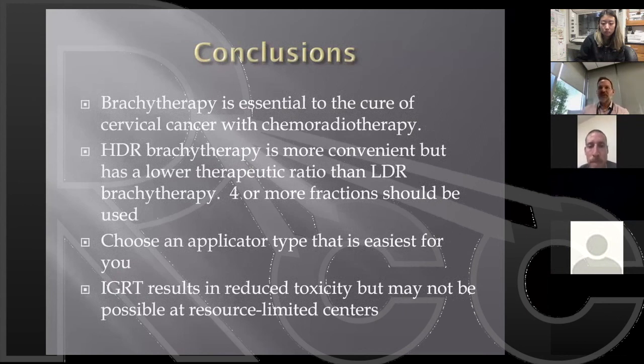In conclusion, brachytherapy is essential to the cure of cervical cancer. I think everybody accepts that in 2019. HDR brachytherapy is more convenient, but really does have a lower therapeutic ratio than LDR brachytherapy. I wrote four or more fractions should be used. You can tell this is our conclusions from an older talk. We really have moved to many patients getting three fractions of 8 gray now. Choose an applicator type that's easiest for you, but also that works with the patient's particular anatomy. And using IGRT results in reduced toxicity, but of course may not be possible in 2019 at some resource-limited centers.